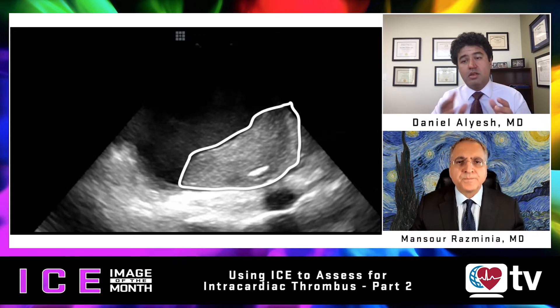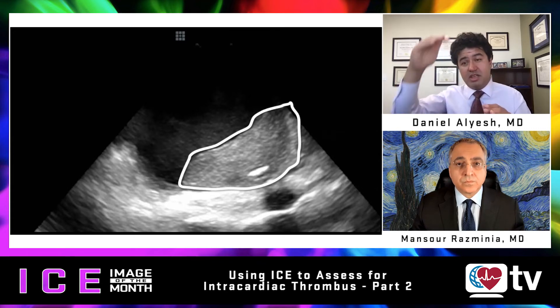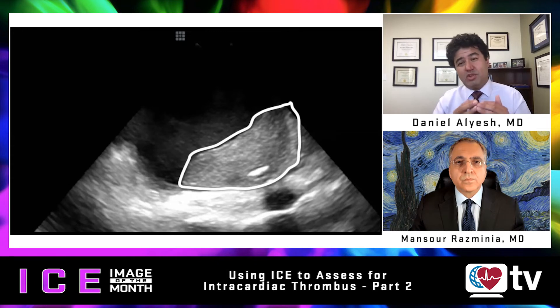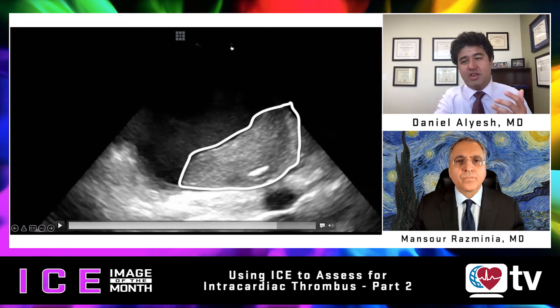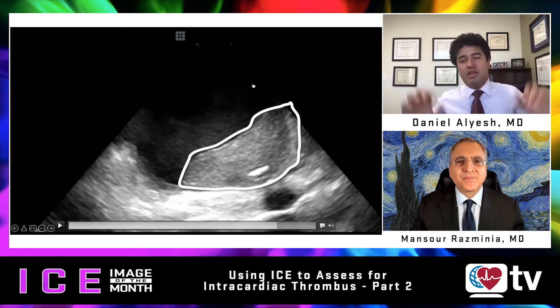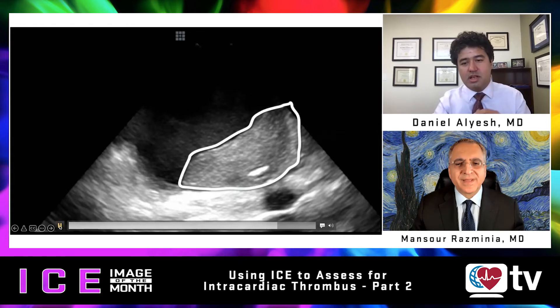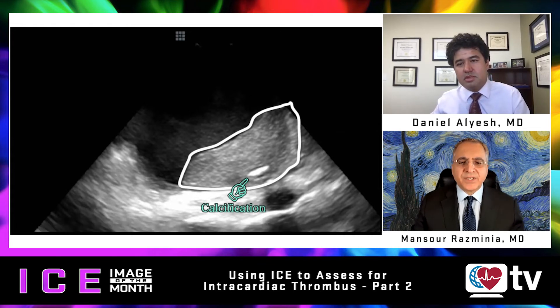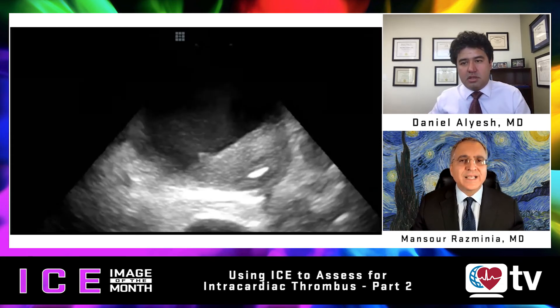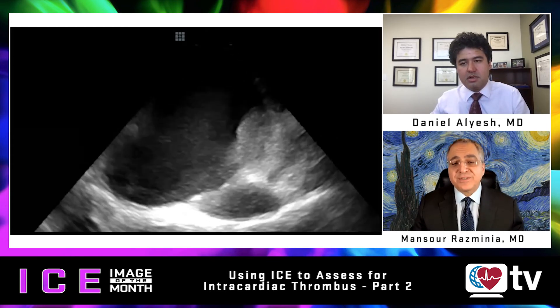I want to touch on the anatomy here: from the RVOT and pulmonary artery you image down onto the appendage, but the coronary sinus runs along the floor of the left atrium. Because the coronary sinus is thin-walled, you don't see the wall — you're looking directly up into the left atrium toward the left atrial appendage. Very interesting and cool views. And that calcification confirms this thrombus has been sitting there for a very long time.